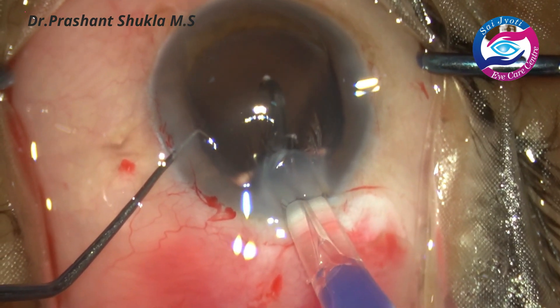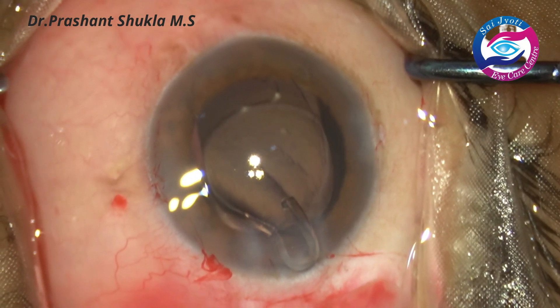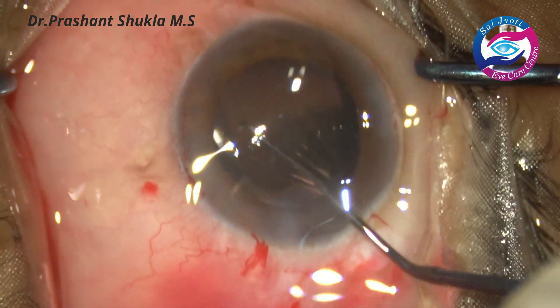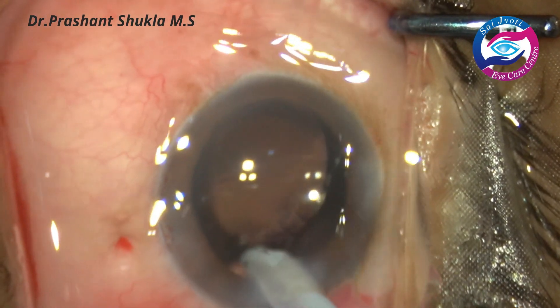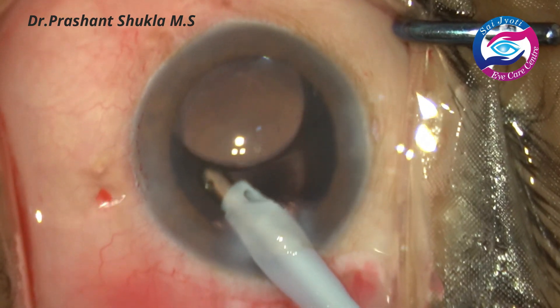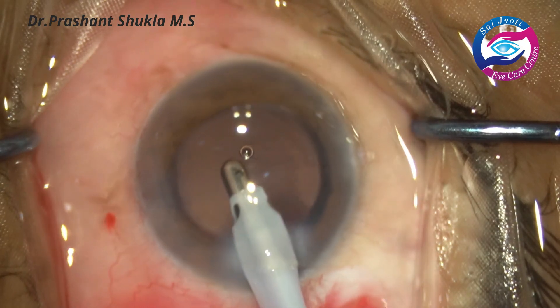In this case we are implanting a foldable single-piece spheric hydrophobic intraocular lens. Once the first haptic is in the capsular bag, the other haptic is also gently dialed in. Similarly, viscoelastic is removed using the coaxial handpiece — first all the viscoelastic in the capsular bag behind the intraocular lens is removed, and then the lens is gently tapped and whatever viscoelastic is in the anterior chamber is removed.